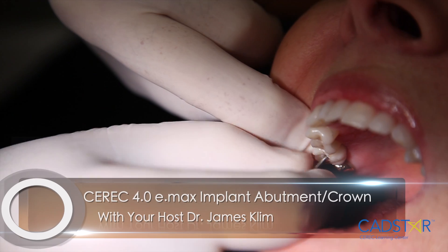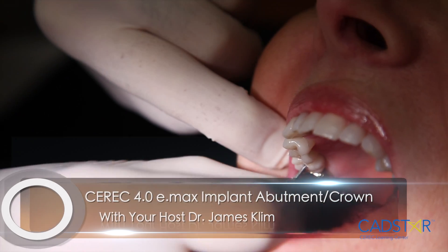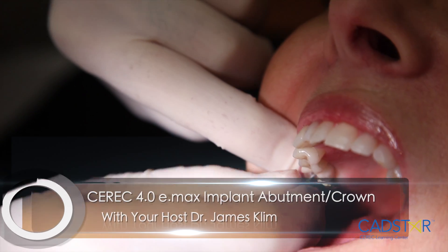Hi, my name is James Klimm. I get a lot of questions about implants and how we're applying them in the CEREC Clinical Theater, particularly now with 4.0.